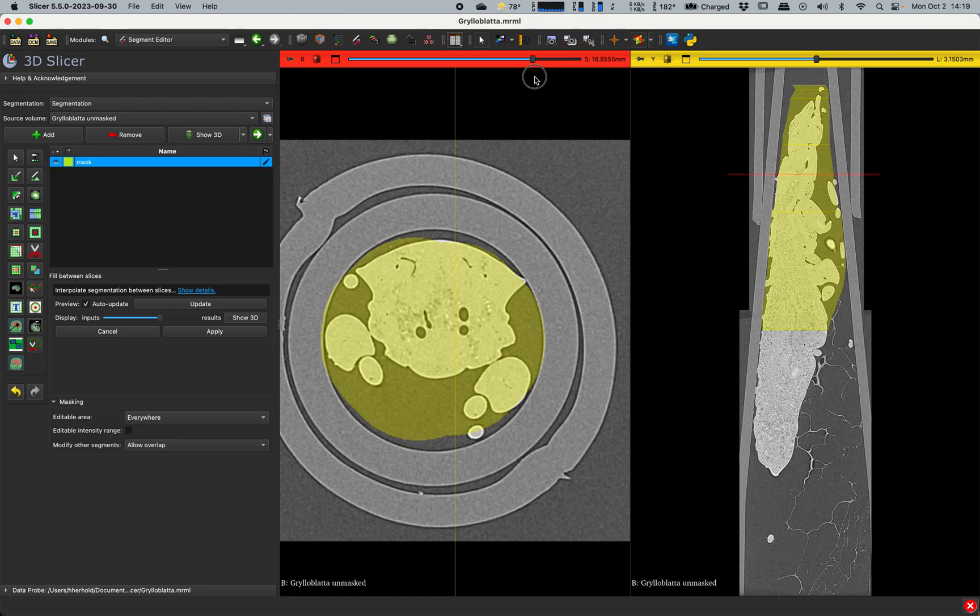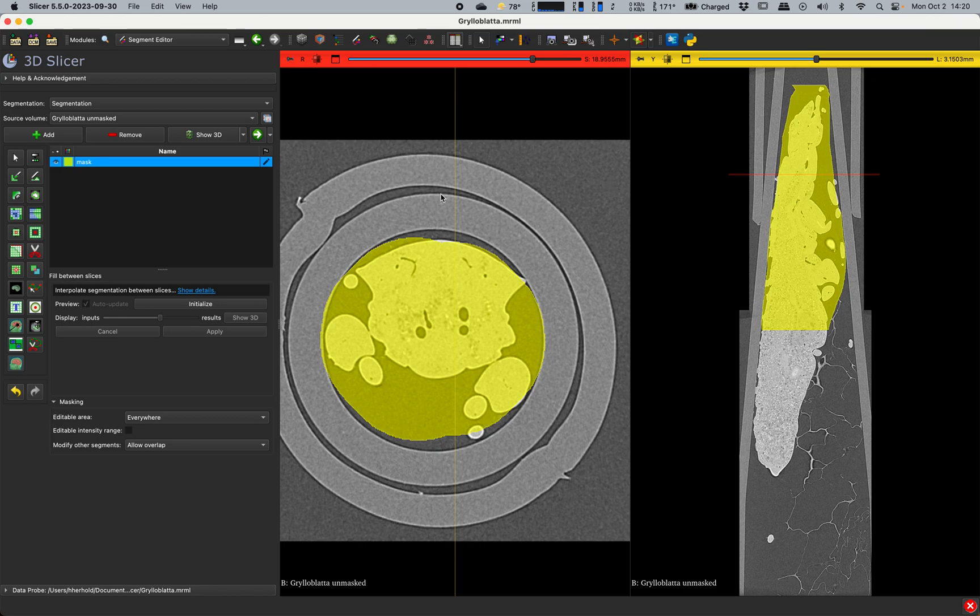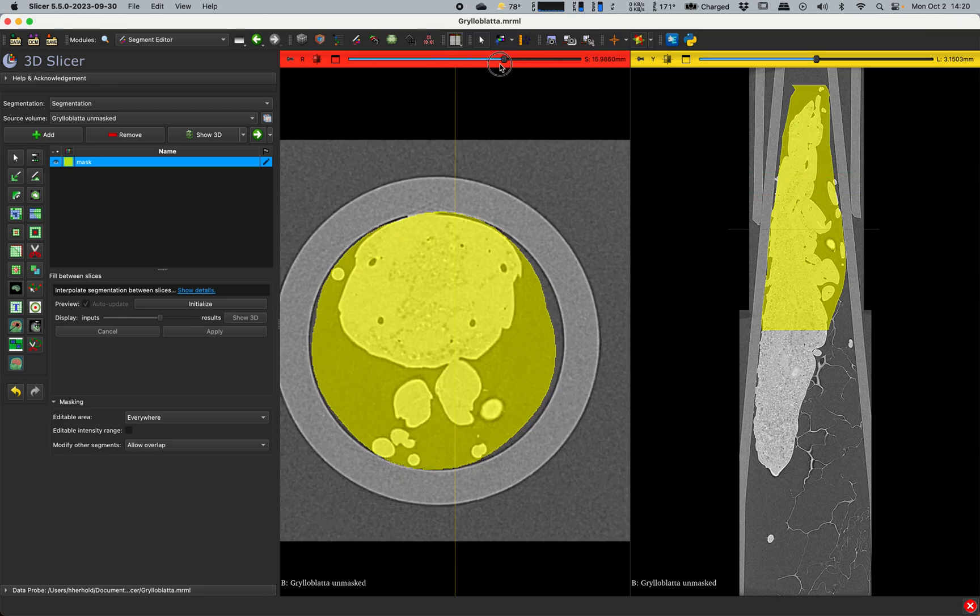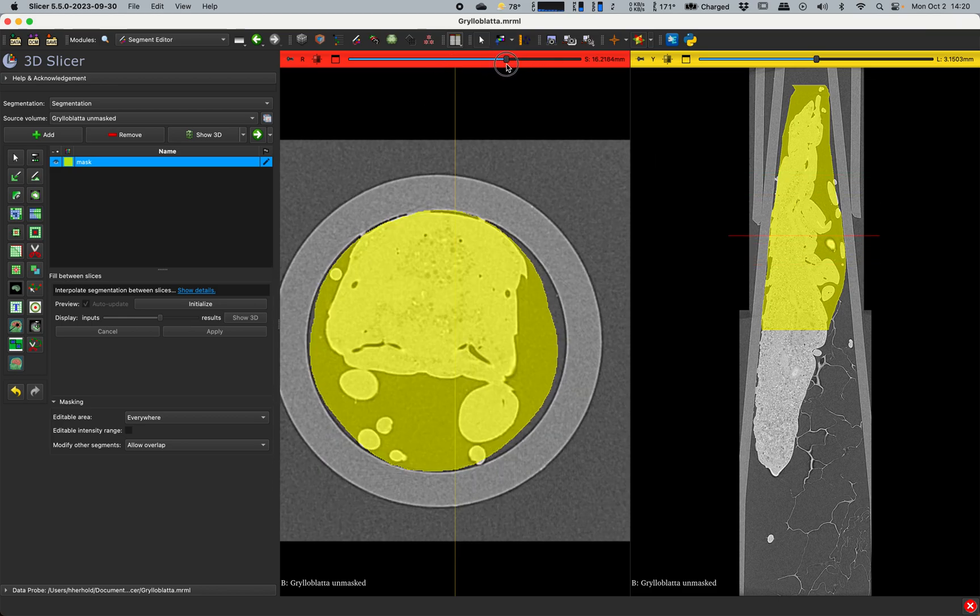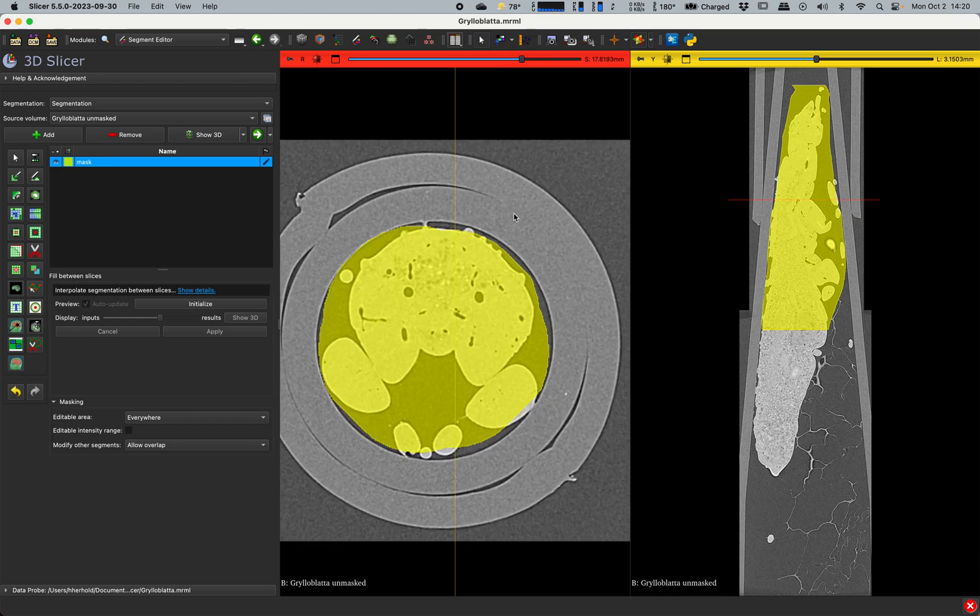It's kind of hard to explain unless you see it. So I will do initialize. It takes a few seconds to do it or depending on how big your volume is, it can take a few minutes. And you can see here it will fill in. It'll make a segment that will fill in all of these areas here. So it interpolates the slices that you did. Now, normally what I would do is I would go in and I would clean this up a little bit to make sure that when it runs through it gets most of what I want. But for the sake of just demonstrating this, I'm going to do it. So we hit apply.